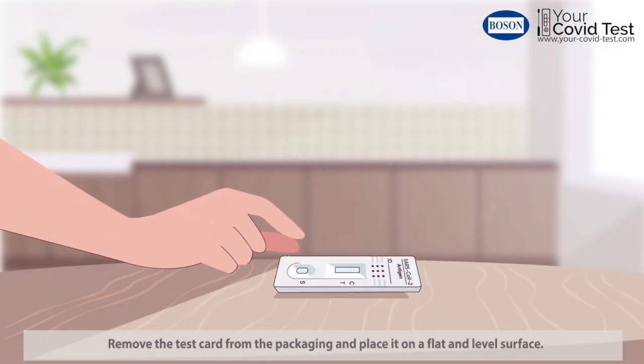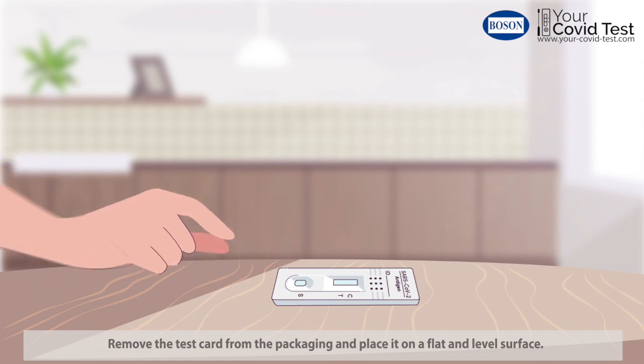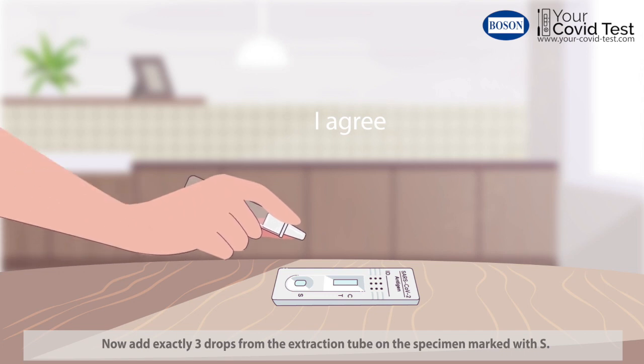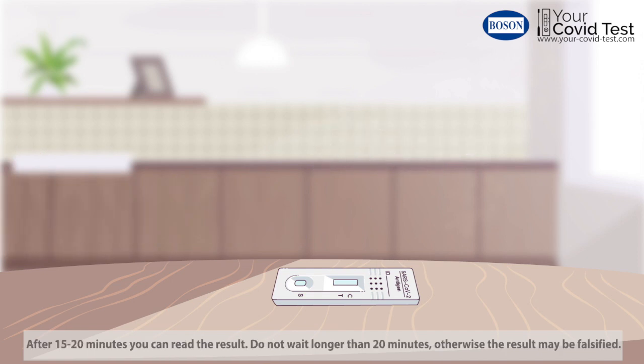Remove the test card from the packaging and place it on a flat and level surface. Now add exactly three drops from the extraction tube on the specimen marked with S. After 15 to 20 minutes, you can read the result.